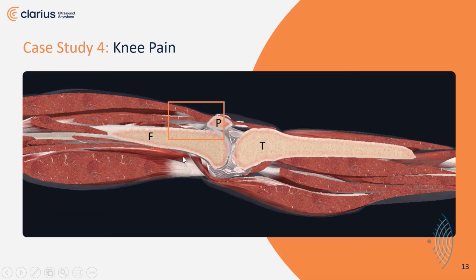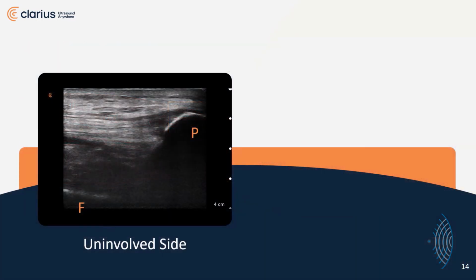You'll see the femur here on the left, the tibia on the right, and the patella in the middle. And you'll recall that you can see the suprapatellar pouch through a window just above the knee cap, where you'll find the quad tendon and the fibers that go to the quadricep muscles. If you look down over that area, you can see here the actual suprapatellar pouch that we saw on the last presentation, and you'll also see that the quad tendon is at the top of the kneecap, and you can see the fibers that represent the three components of the quadricep muscles.